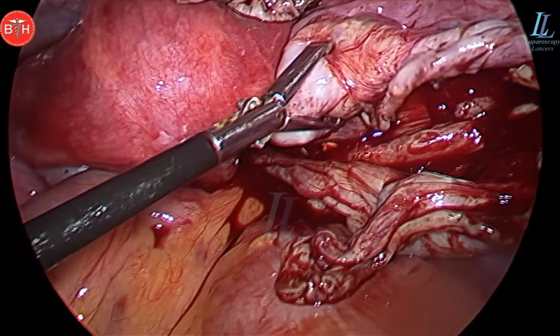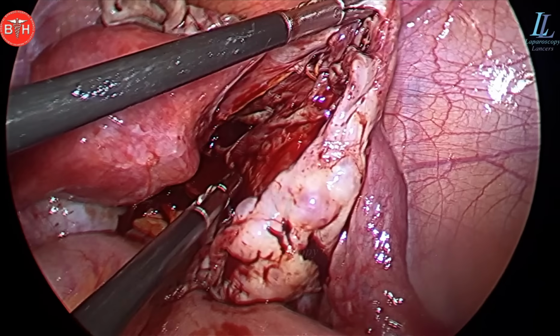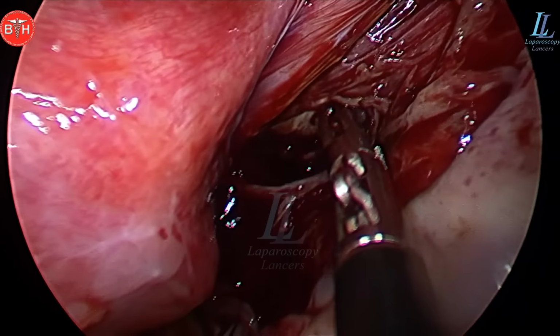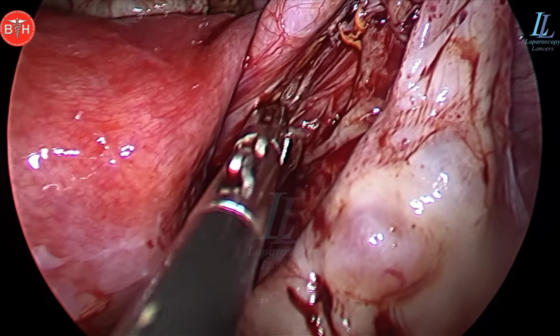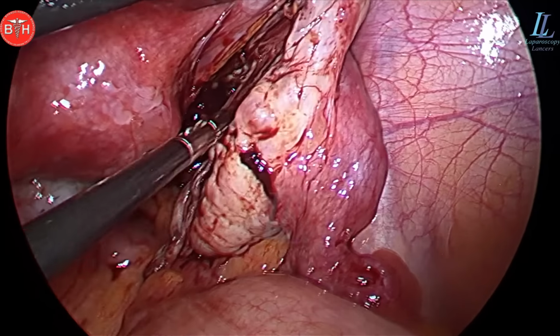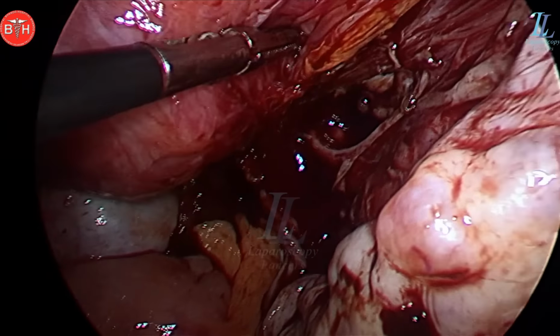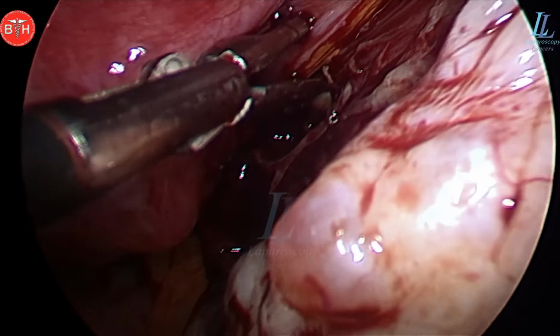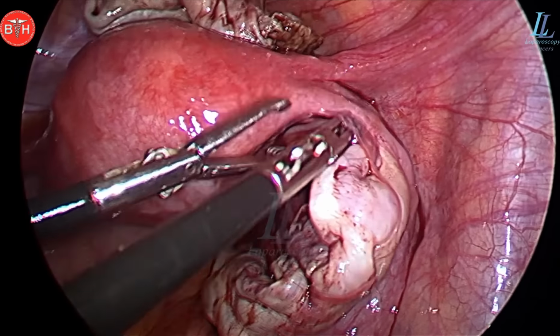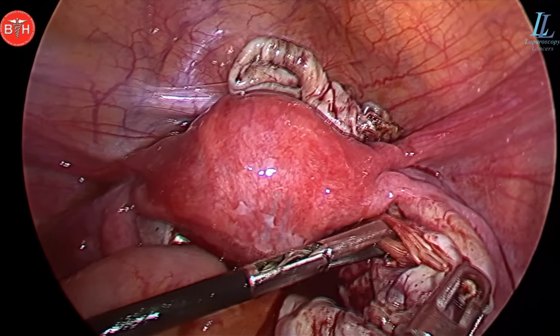They are searching for endometriotic cyst again, as I was in doubt that something bulging laterally is seen, that I have to pull it from inside. You can see doubts are always there. It's like a policeman. The surgeon should also always be in doubt. That boggy structure has to be something. We can't leave it there. And later on the USG will show a chocolate cyst remaining, and that will be bad. Though initial ultrasound was not showing it, as the first cyst was so big that the ultrasound could not differentiate it.